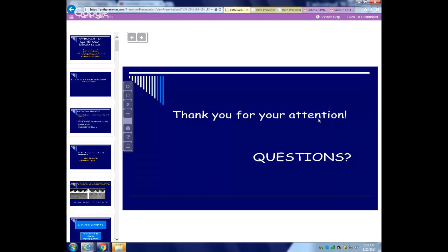So once we have all the content on Widex, which is widex.com, what is your diagnosis? You will link both PathPresenter and Widex. So you can look at the slides here, use this platform for presentation, but for self-learning, if you want to find information about a specific diagnosis, the connection is going to be to Widex, where you will get all the information about that specific diagnosis. So hopefully this will make a complete platform for learning, sharing, teaching pathology that you can use from anywhere or any place in the world actually.